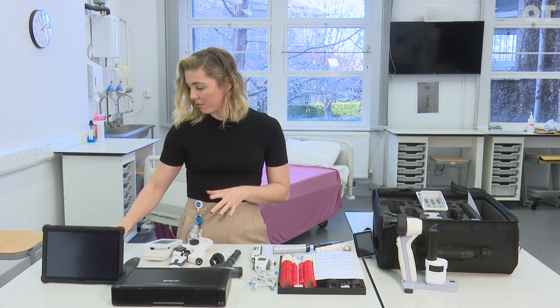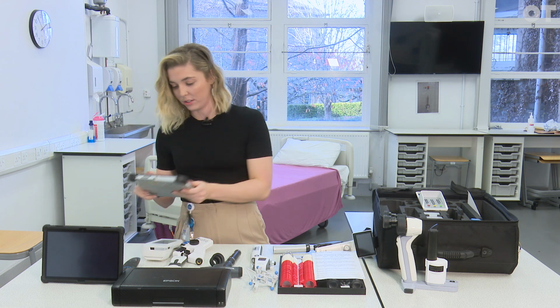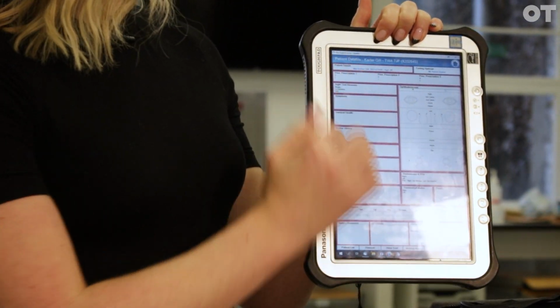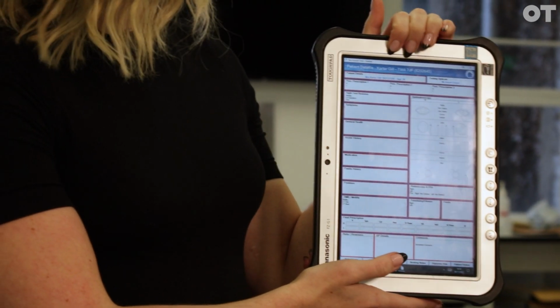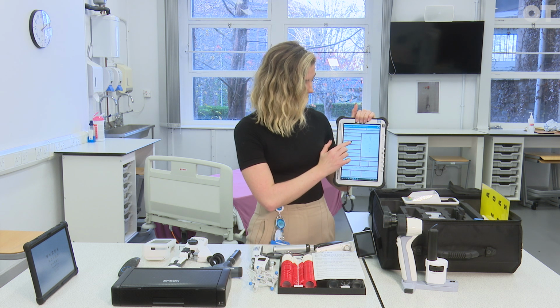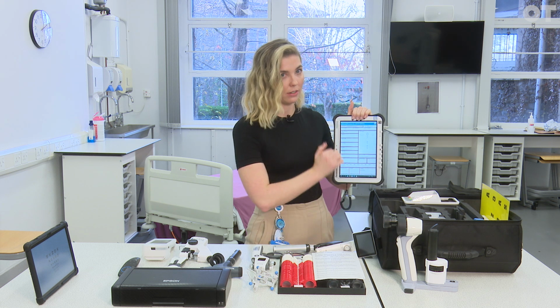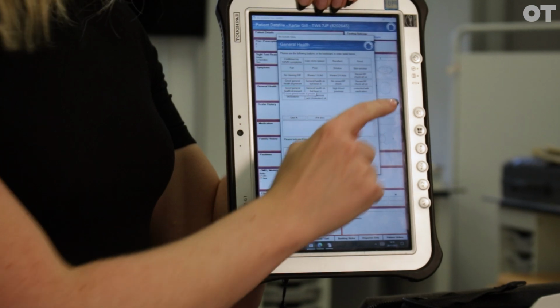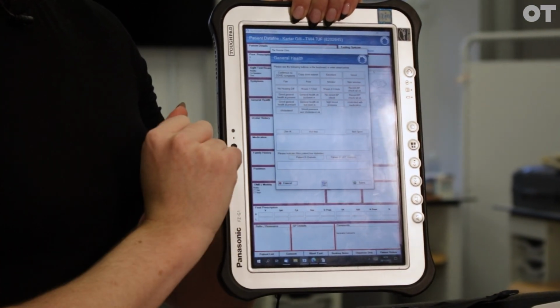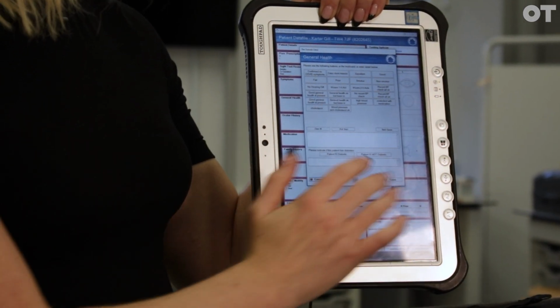The last thing we have is just the tablet for our records. All of our patient records are stored on the tablet. We input them bit by bit. Everything on our record card is all on the same screen, which is really useful. One of the features that we have on our records is that everything is lit up in red, as you can see around each box. Once you click on a box, it'll give you pre-filled parts to put into the record. You can change the preferences for what you want your buttons to be.